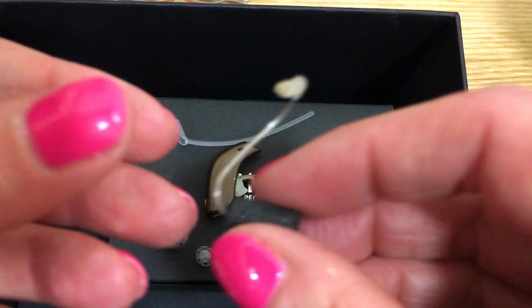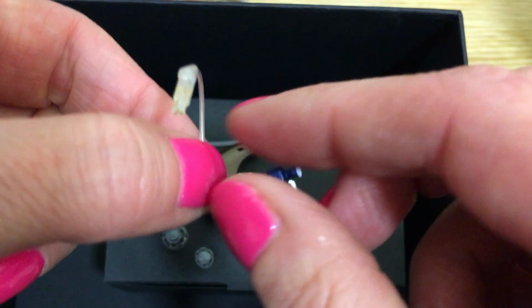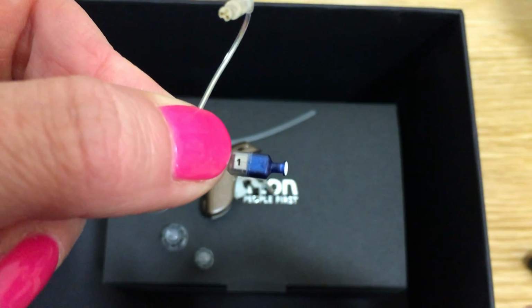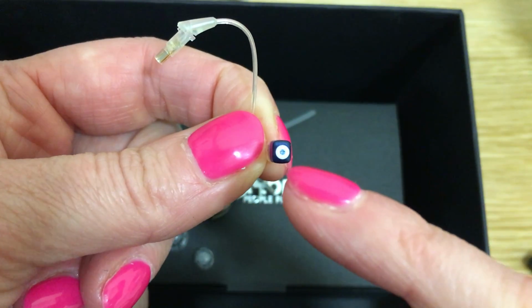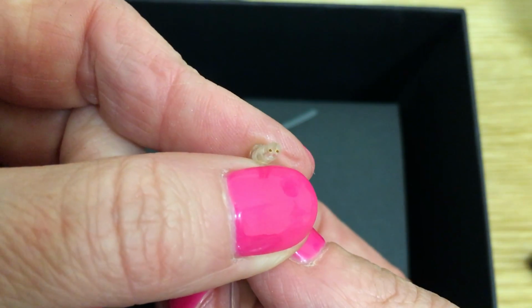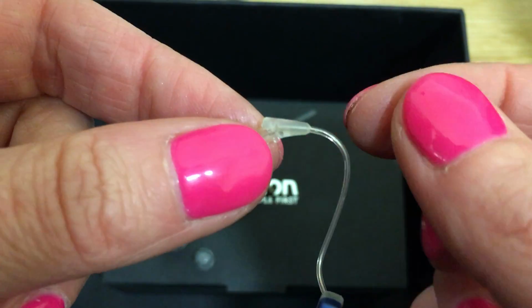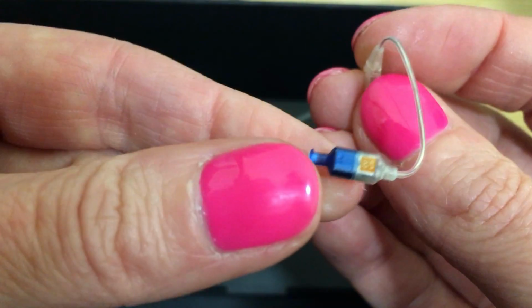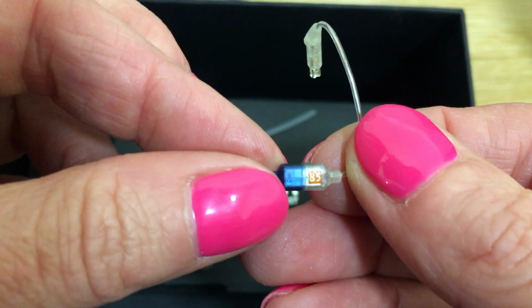First of all, we remove the protective foam around the speaker. Here we can see the size. It's a size 1 speaker for the left ear, as it is marked in blue. At the end here we have the wax filter. This end has some tiny socket points which plug into the instrument. These connect to fine copper wires which carry the sound from the instrument into the receiver or the loudspeaker, which delivers the sound into the canal.